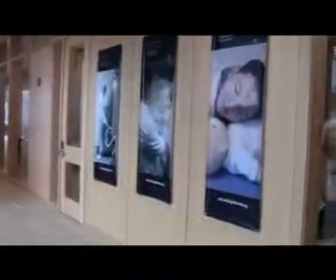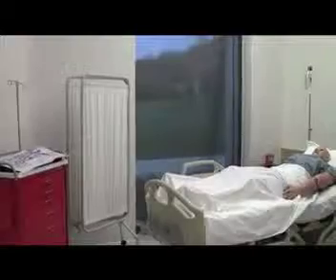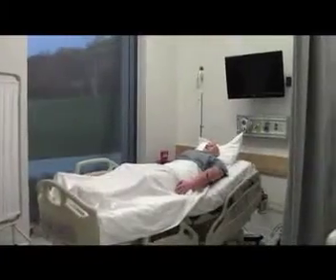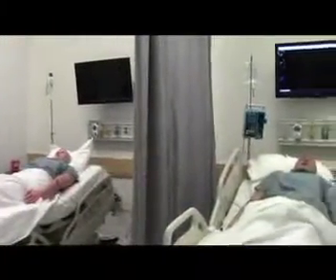The correct terminology is actually human patient simulator, and these are high fidelity human patient simulators. Fidelity is essentially making it as lifelike as possible. So simulators come in two large groupings: one is low fidelity, less lifelike, and high fidelity, more lifelike. The closer to real life that you have, the better really for most standards.